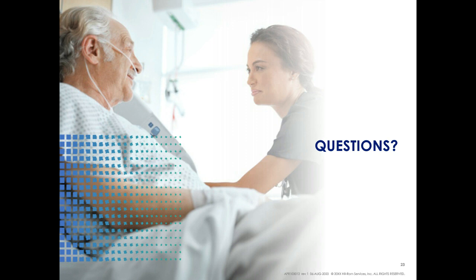Something to consider when you're acquiring vital signs on most patients is patient compliance, so a patient who's not talking. Those types of activities are really important for a fast and accurate reading, but about a 45-second window is what you should expect.